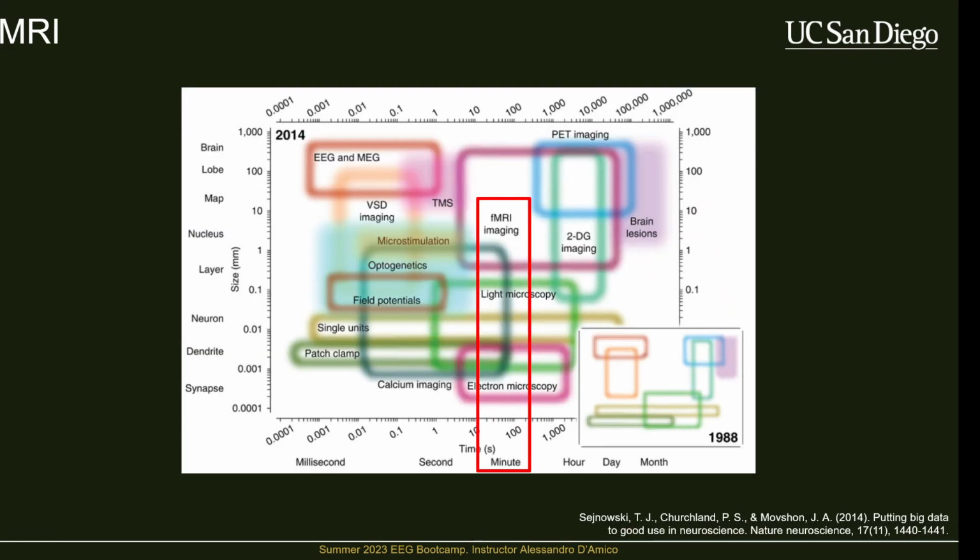That's a base definition for it. Again, it has very poor temporal resolution. It takes seconds to minutes. The sampling rates of these are really, really slow. Sampling rate essentially is just how often it's pulling a sample from the imaging technology.